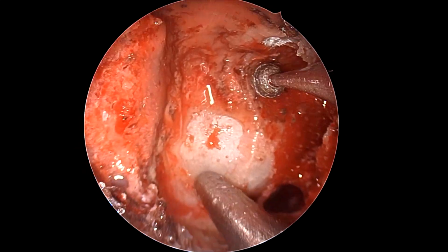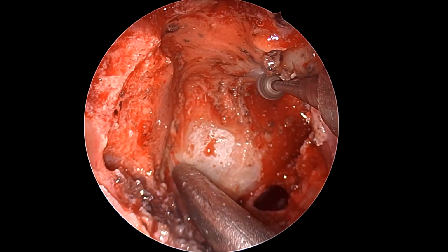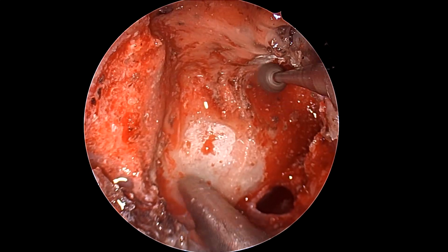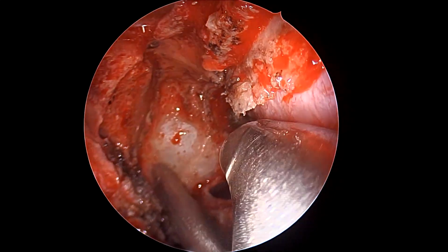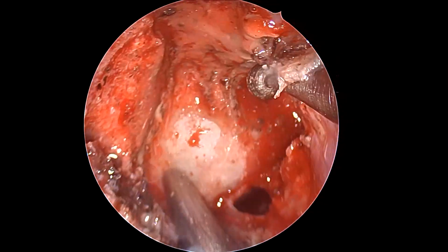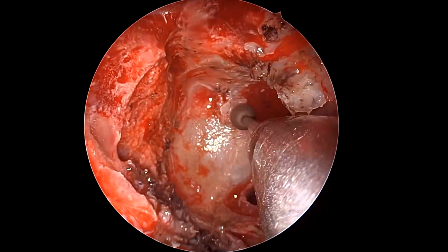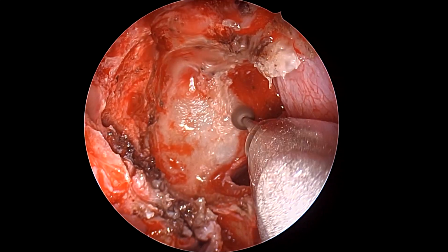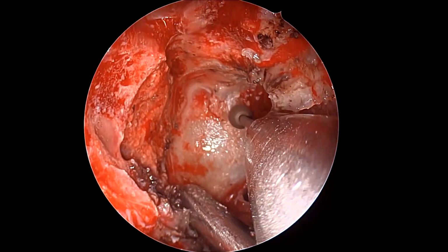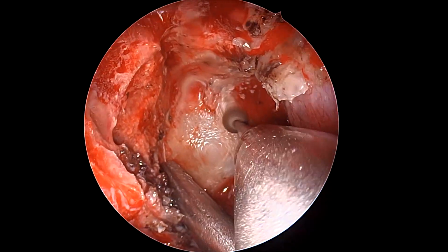You can see that we are going on the planum, drilling completely because it has a suprasellar extension. So we are drilling generously to make all the margins smooth and flush. We want a clean, flush cavity with no overhanging edges, because the overhanging edges and ledges of bone don't just impede vision; they also significantly impede instrumentation, because most of the instruments we use here are straight, and that's how it's supposed to be.